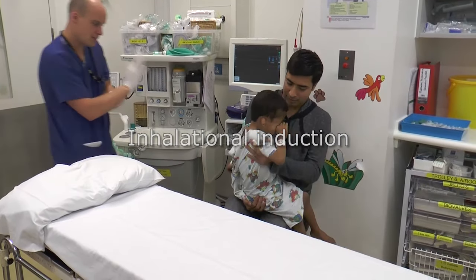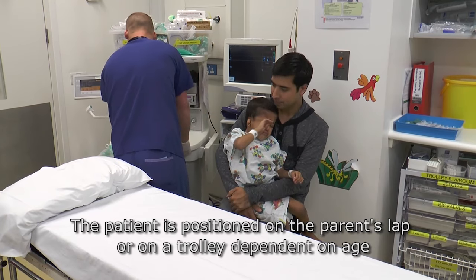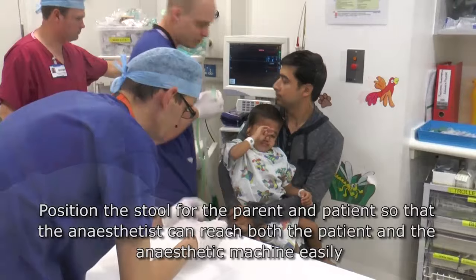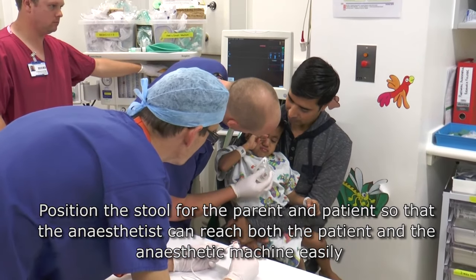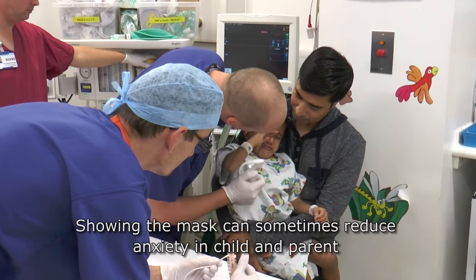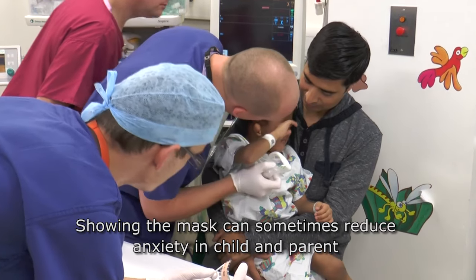Inhalational induction. The patient is positioned on the parent's lap or on a trolley dependent on age. Position the stool for the parent and patient so the anaesthetist can reach both the patient and the anaesthetic machine easily. Showing the mask can sometimes reduce anxiety in child and parent.